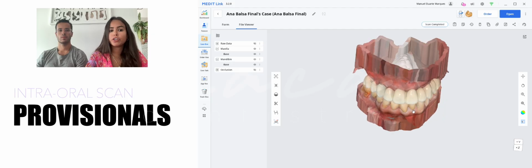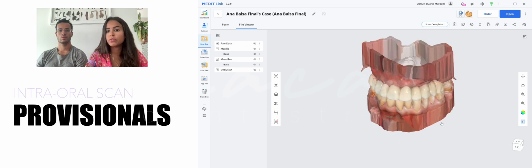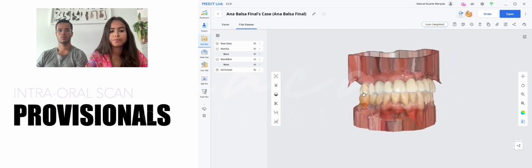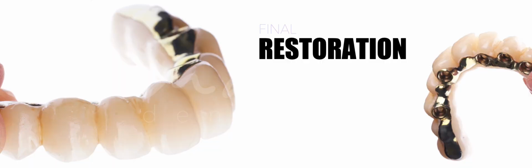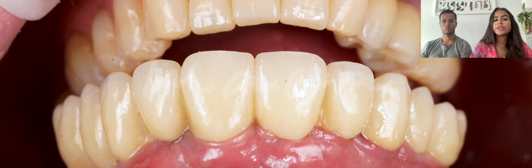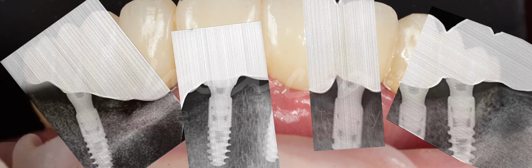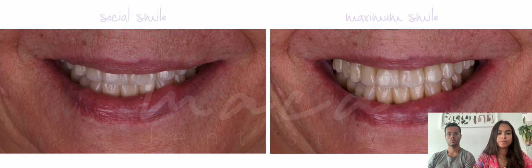Again, we scanned the provisional restorations of the patient inside and outside the mouth to obtain important references for the final prosthesis. And here you can appreciate our final prosthesis, some more pictures of the final restoration, and this is a metal framework and zirconia. Here the pictures immediately after placement of the final prosthesis. Another picture. These are the periapical X-rays confirming the fit of our prosthesis to the OMNI abutments.